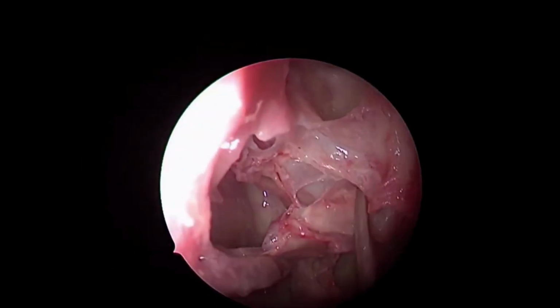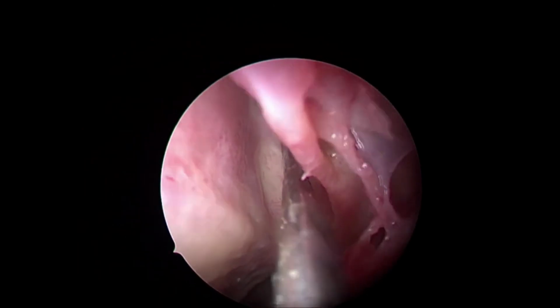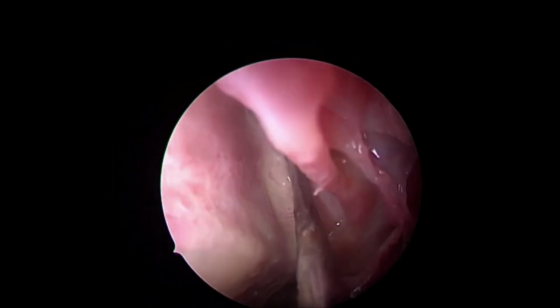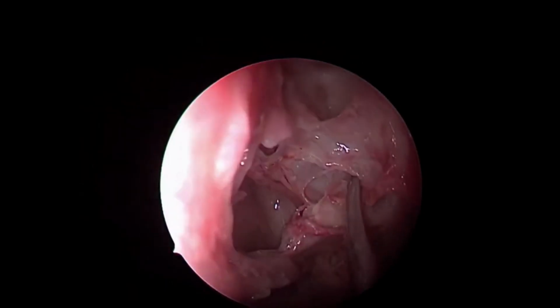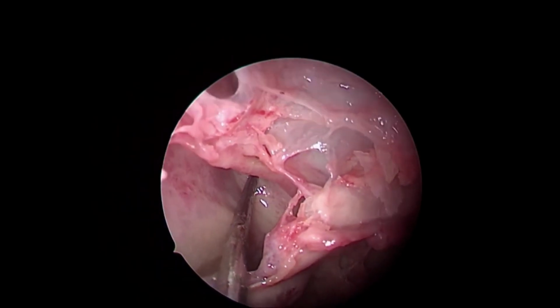Before doing the posterior ethmoidectomy, I need to develop a landmark of the sphenoid sinus ostium, which you can see here. Why so? Keeping in mind this sphenoid sinus ostium as the posterior limit of the posterior ethmoidectomy, I would never enter into the sphenoid beyond the limit of the sphenoid ostium to damage anything.